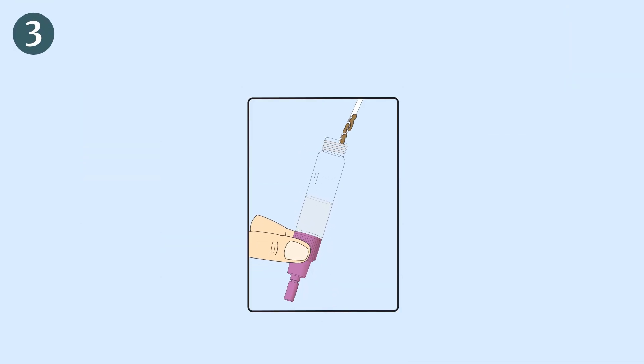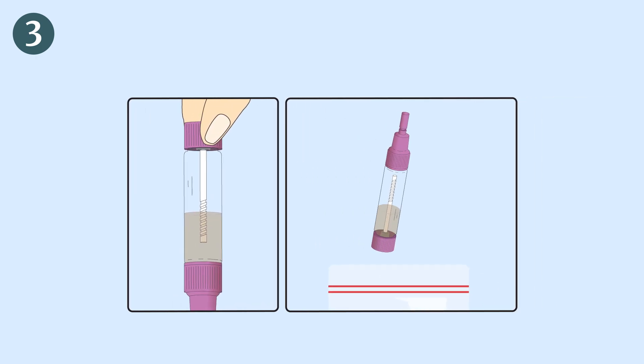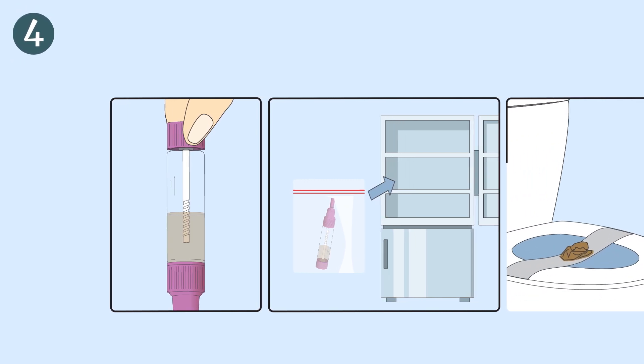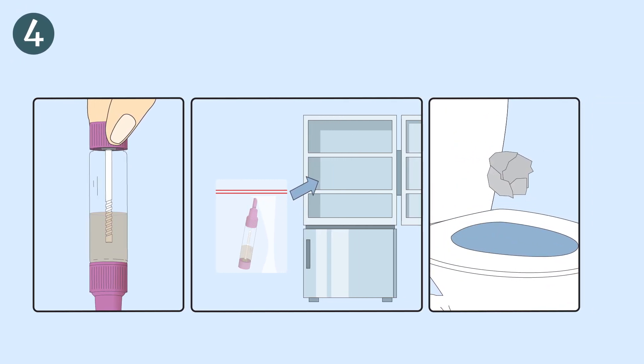Put the white cap containing the feces sample back in place onto the dilution vial. Screw it firmly and shake well to re-suspend the feces sample. Put the sample dilution vial back into the plastic bag and keep it in the refrigerator. Remove the collection paper strip and dispose it in the toilet.